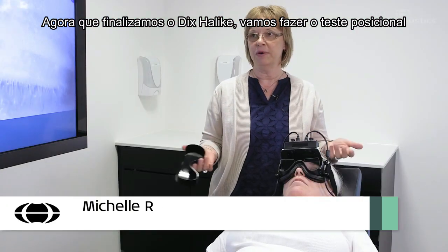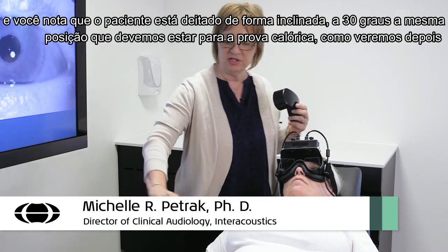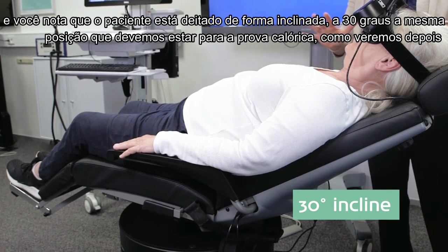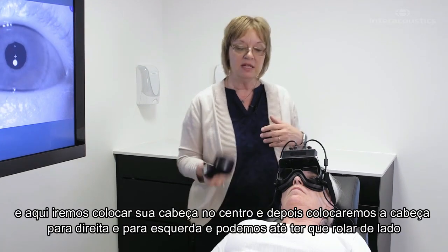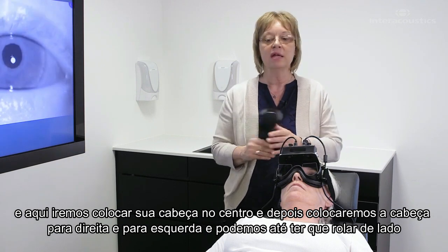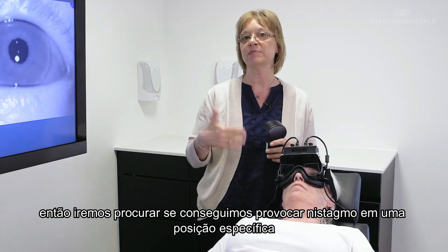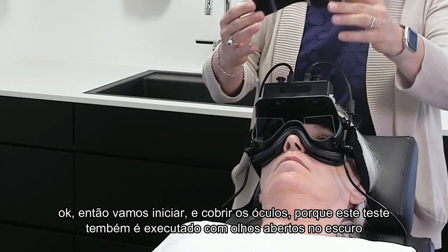Now that we've finished the Dix-Hallpike, we're going to do the positional tests. You'll notice that the patient is lying at an incline — a 30-degree incline. This is the same position she would be in for the caloric testing that's coming later, which is why she's in this position. We're going to put her head in the center, then to the right and to the left, and we may even roll her on her side, to see if we can provoke nystagmus in a specific position.